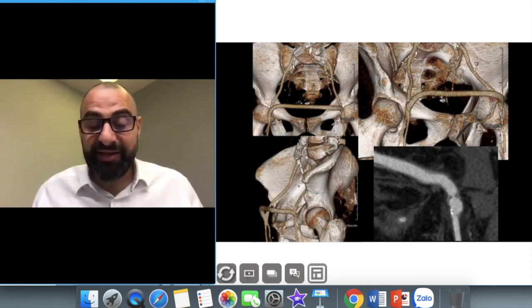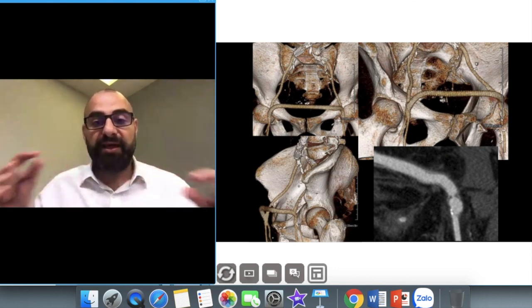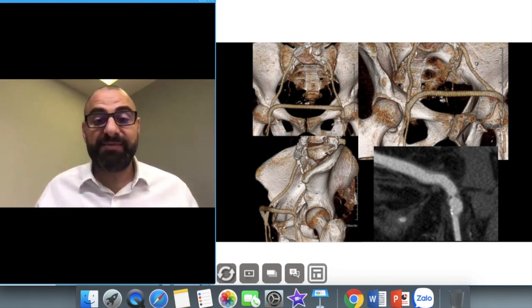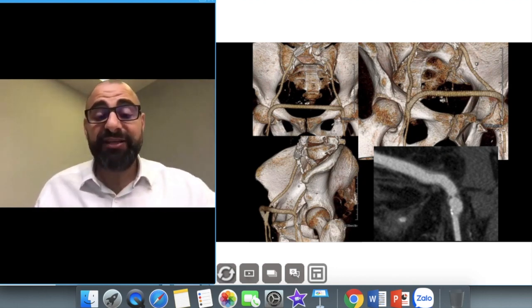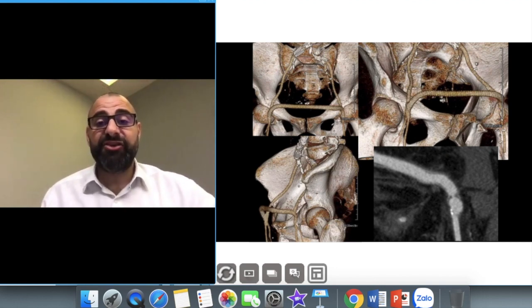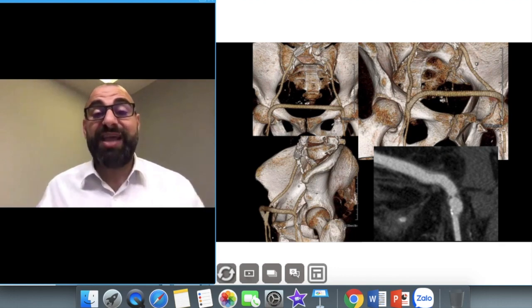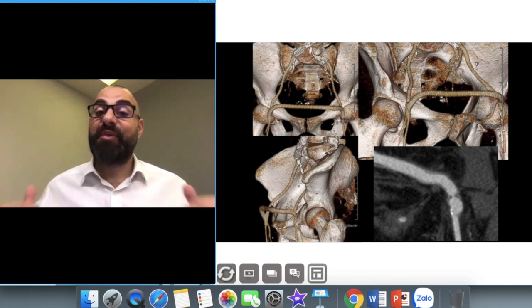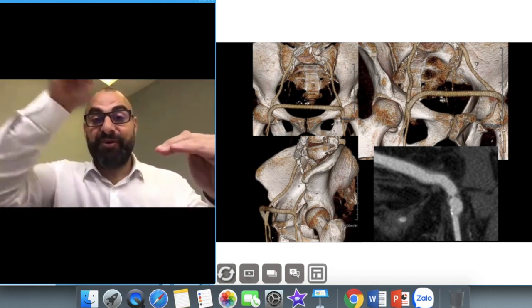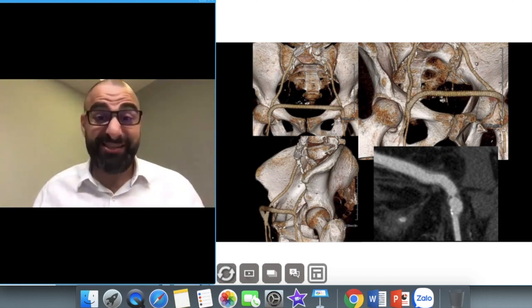This is an example of a lower limb angiogram where a bifemoral bypass was performed because there was no blood supply going down the left side. At the level of insertion on the left leg there was 99% stenosis, and after the stenosis there was a large aneurysm. This is why I always like to monitor at the popliteal fossa — whatever happens at the top will flow in the right direction as it should.